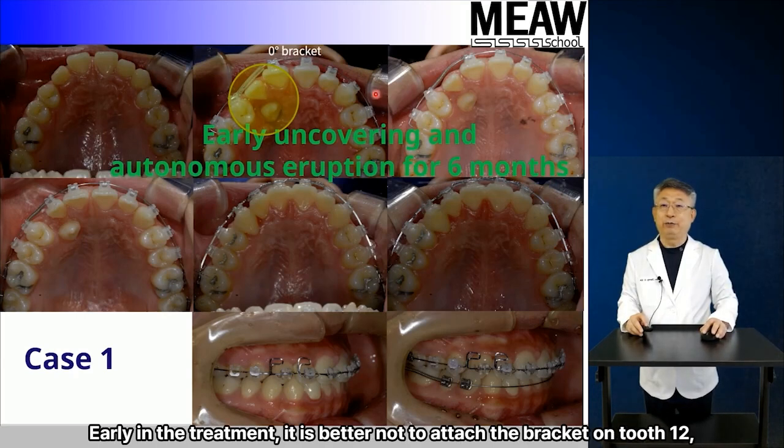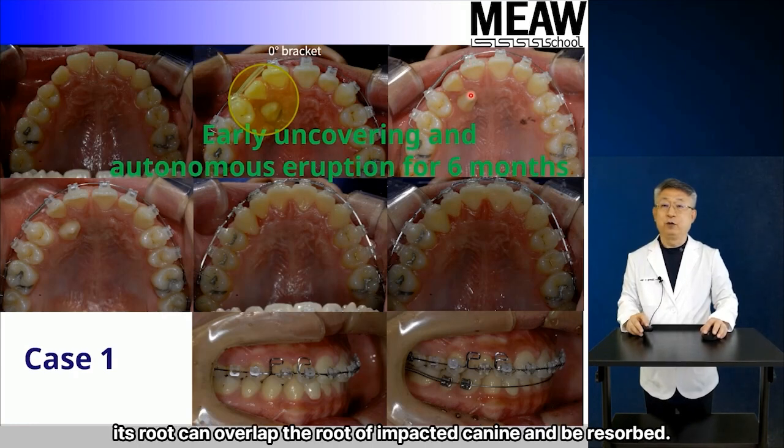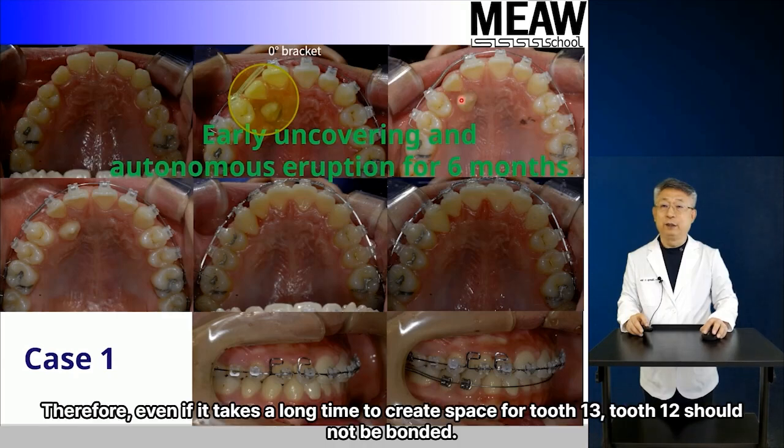Early in the treatment, it is better not to attach the bracket on tooth 12, because if it is bonded and open coil spring is used to create space, its root can overlap the root of impacted canine and be resorbed. Therefore, even if it takes a long time to create space for tooth 13, tooth 12 should not be bonded.